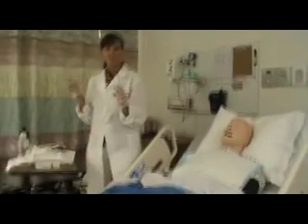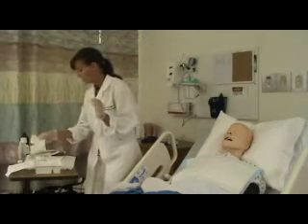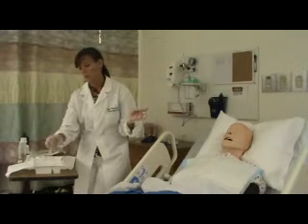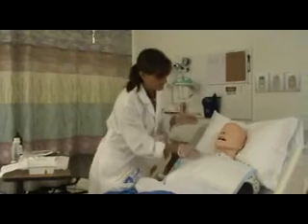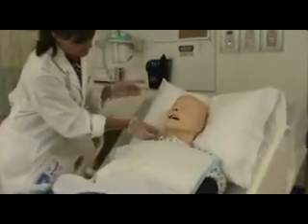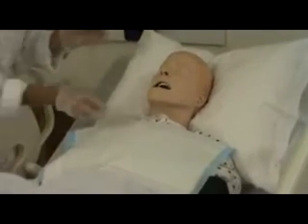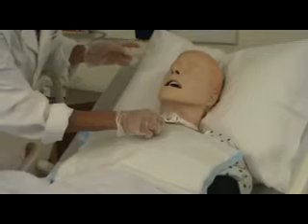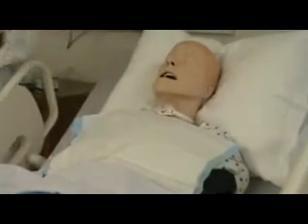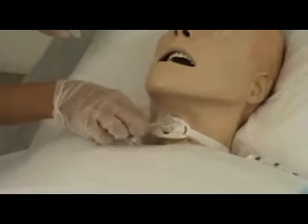Let me check our instructions. I'm no longer need to be sterile, so now I'm going to clean around the face plate. This is where your Q-tips come in — you can go into your saline and wipe underneath. She's removed the dressing and she's cleaning gently with her swab. If there's a lot of gunk around there, which sometimes is the case, you can go in the saline and clean with the 4x4.